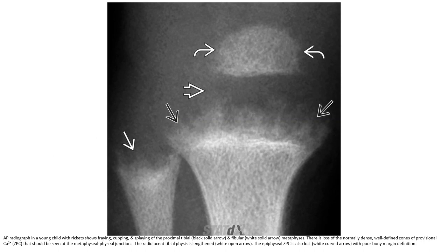AP radiographs in a young child with rickets show fraying, cupping, and splaying of the proximal tibial and fibular metaphysis. This represents loss of the normally dense, well-defined zone of provisional calcification (ZPC) at the metaphyseal junction. The radiolucent tibial physis is lengthened. The epiphyseal zone of provisional calcification is also lost, with poor bony margin definition.